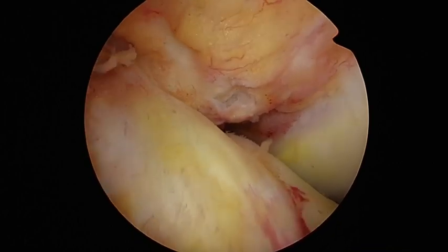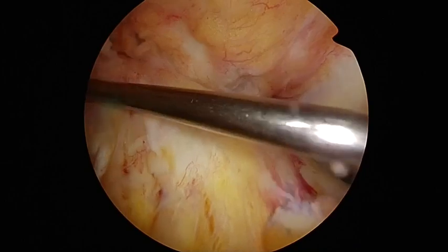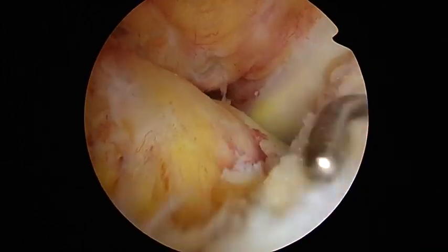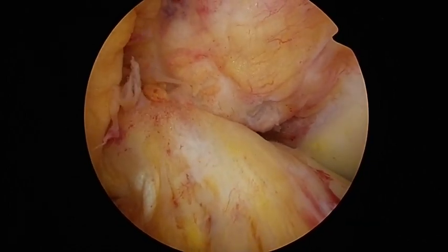Finally, during the anterior arthroscopic visualization, it is confirmed that sagging is resolved and the ACL is properly tensioned, while also ensuring that both the ACL and PCL are completely preserved.